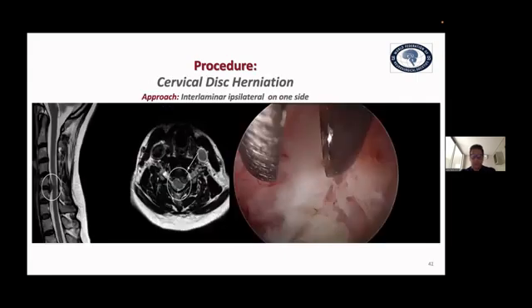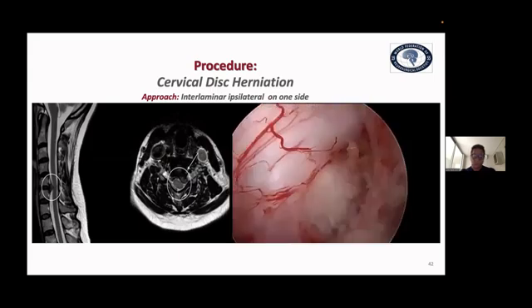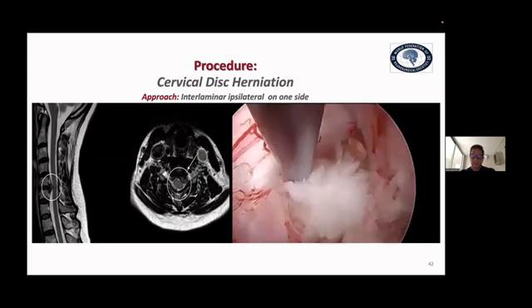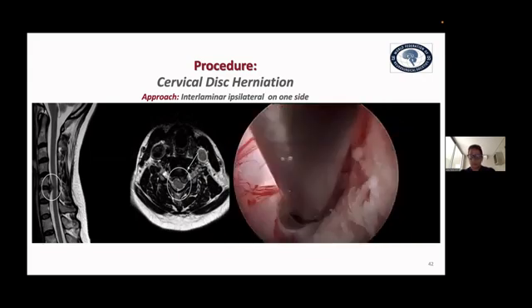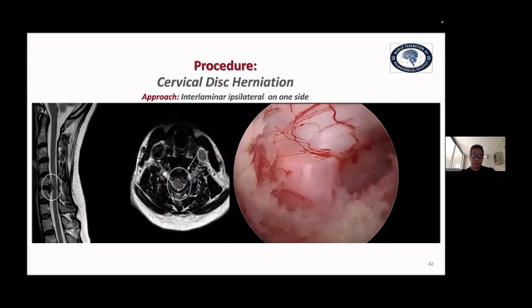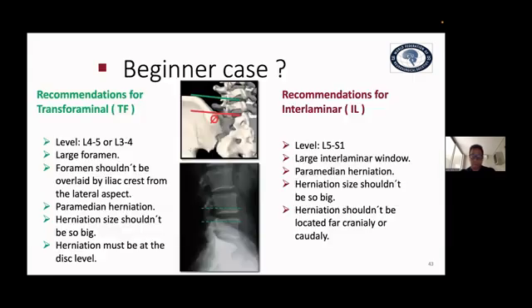You can also perform cervical disc removal with only a skin incision of 5 millimeters. You can always use a shorter and thinner instrument to remove disc herniation on the cervical spine and decompress. Also, you can treat stenosis in the cervical region. Foraminal stenosis is also possible to treat with these kinds of approaches.